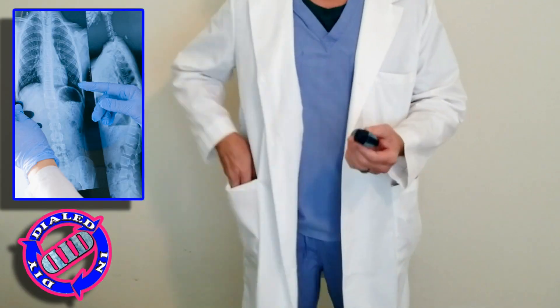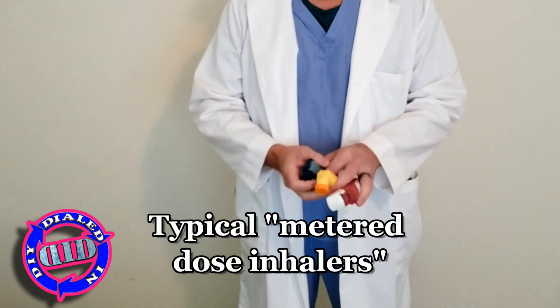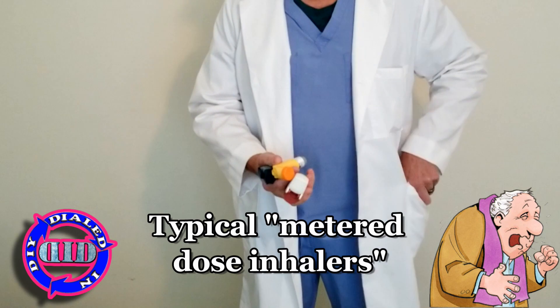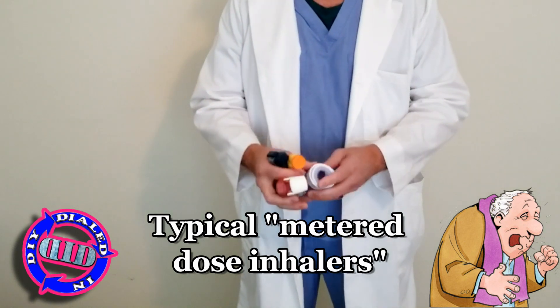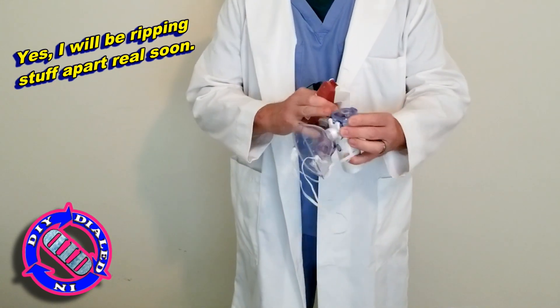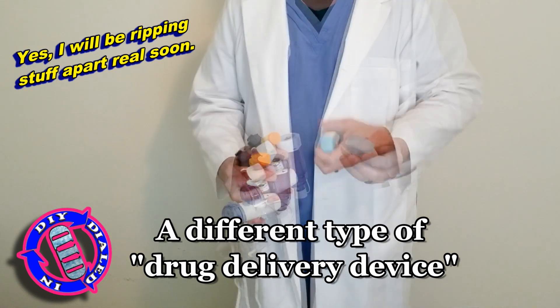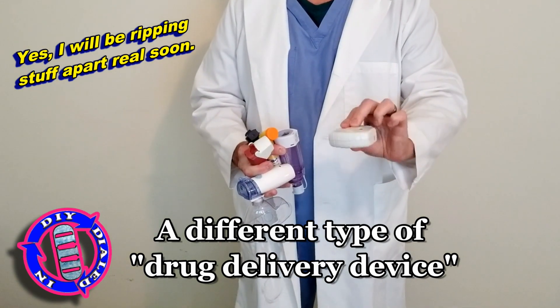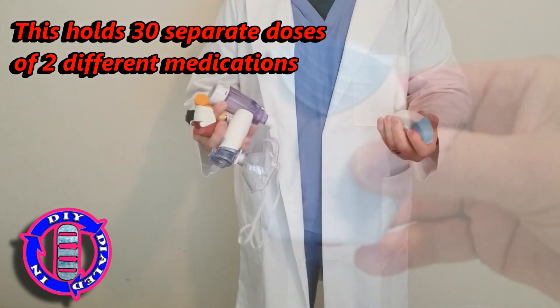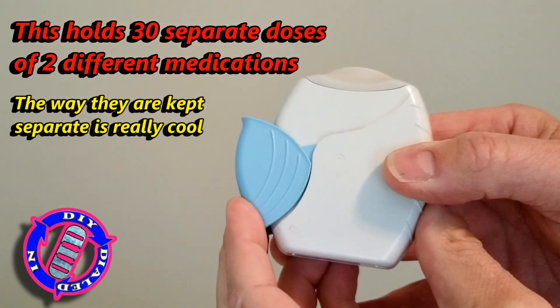Getting medications into the lungs to treat illness has been done in one of a couple ways that's been pretty much the same over a period of time. It typically involves an inhaler and maybe a spacer or some kind of a nebulizer. Either way, it's not always the most convenient. But there have been advances, including this dry powder delivery device, that makes it much easier to get inhaled medications where they need to be.